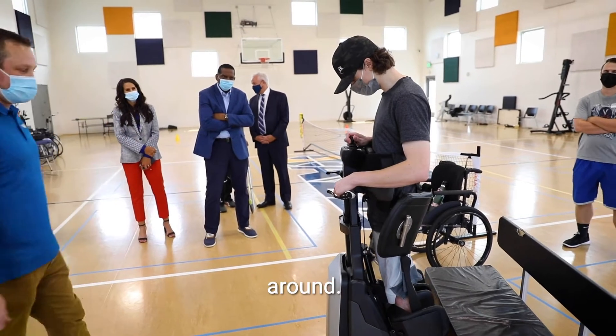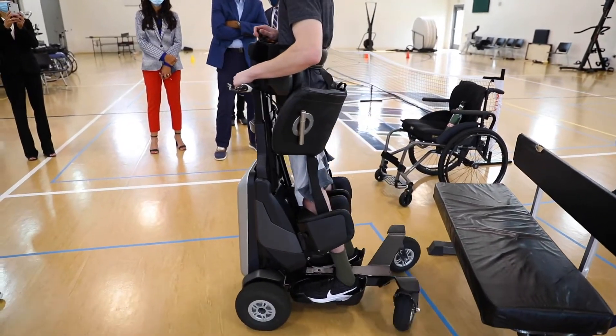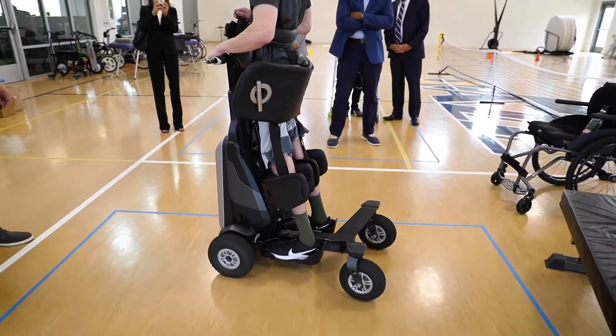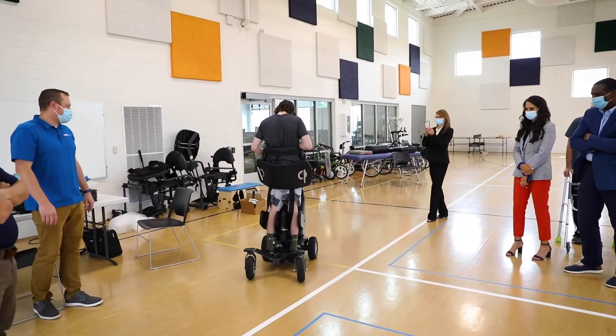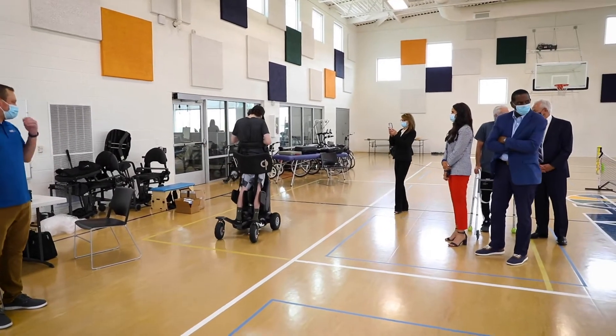So when you feel ready, you can go ahead and start to drive around. Let's go to the kitchen.